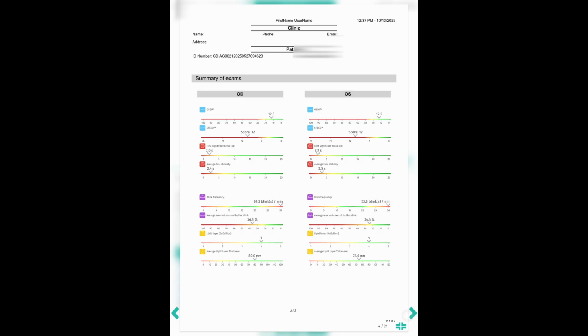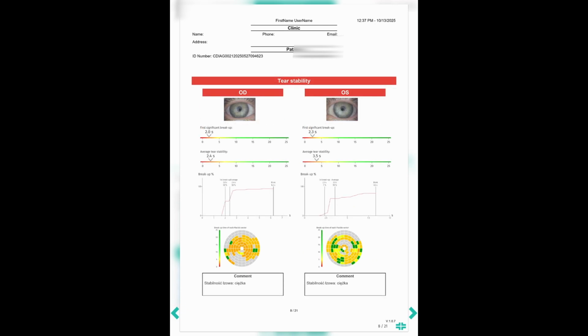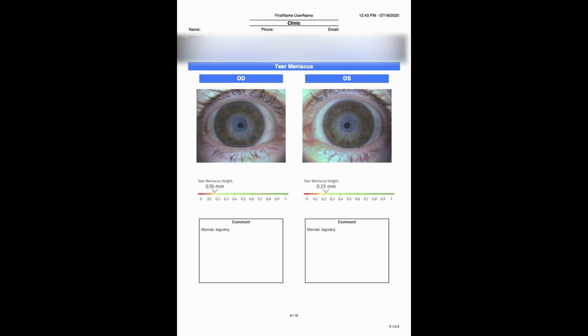You can convince them. Or on the other side, patients with neurotrophic keratitis usually don't feel much problem, yet the ocular surface is very bad. So it's great. And then definitely this tablet that's on the side really helps to do that. On the other side, I wish this tablet was a touchscreen. I really do, because then the patient can do the questionnaires, let's say, in the meantime.